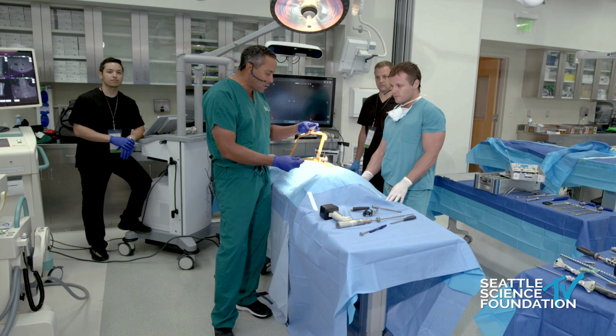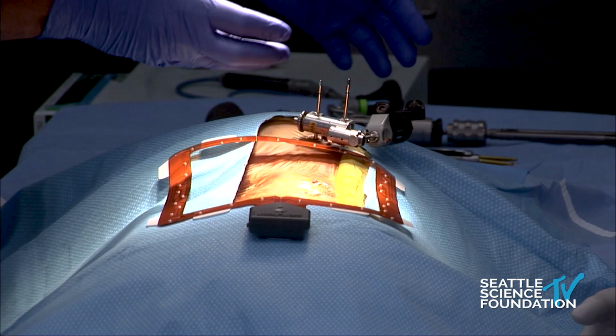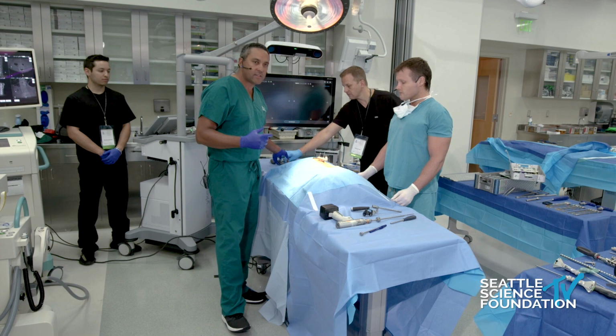One of the really cool things about this system is that they have this spine mask, which you can fit on the skin. It just affixes to the skin with adhesive. So there's no tracker that's necessary. You don't have to pin anything to the patient. It's on the skin. You do a spin, and then that automatically registers to the system. That isn't what we did today. Today we used a tracker.